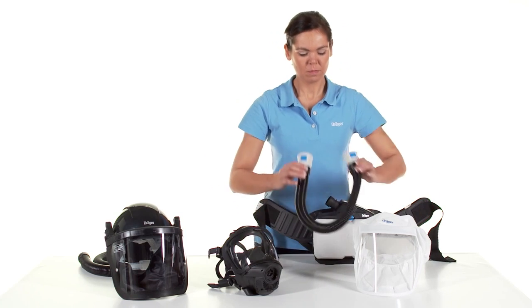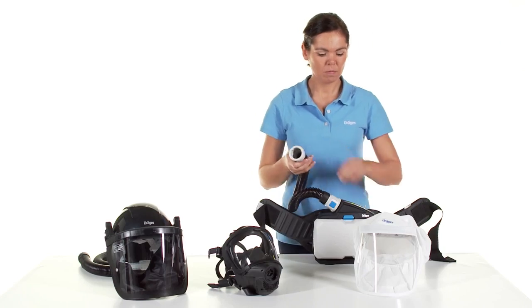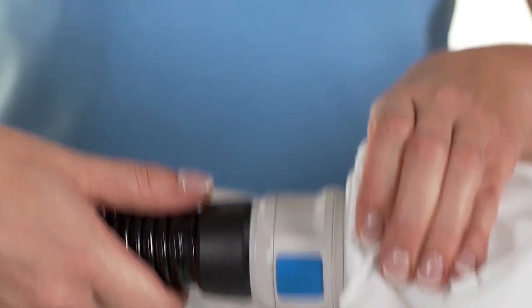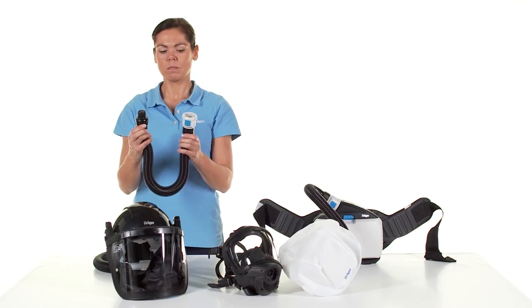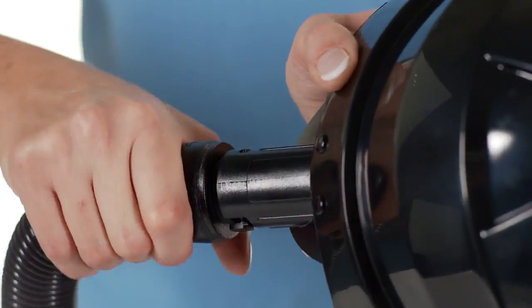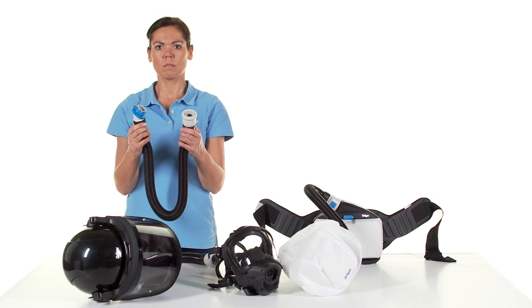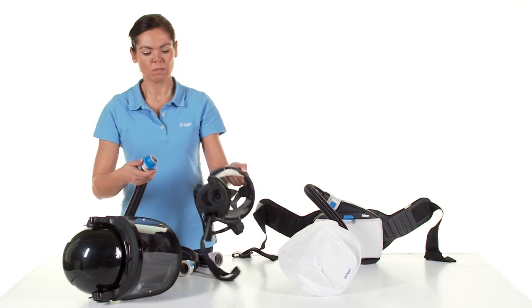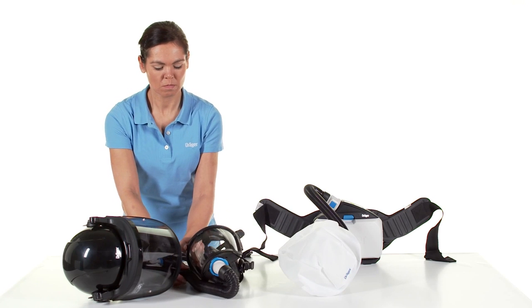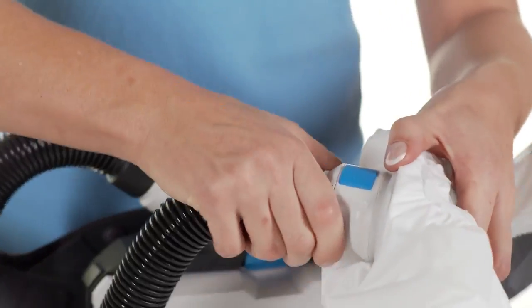To connect the breathing hose, take the hose and plug one of the two hose connectors onto the coupling of the device. Slightly turning the hose connector until it audibly clicks into place helps to establish the connection. If you have selected the breathing hose for a hood, connect the hose connector the same way with the headpiece. For a helmet or visor, connect the hose connector with the coupling. For a mask, screw the standard thread connector onto the corresponding mask. Make sure that all connections between the breathing hose and unit and the headpiece are fastened securely or snapped properly into place.